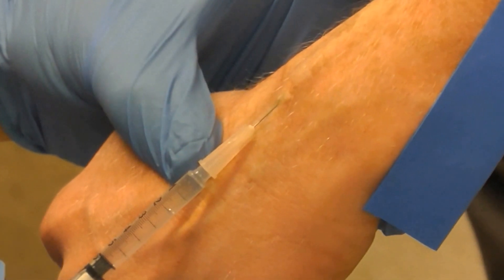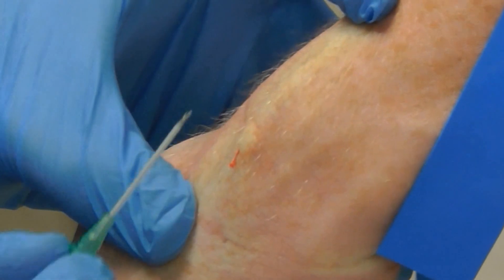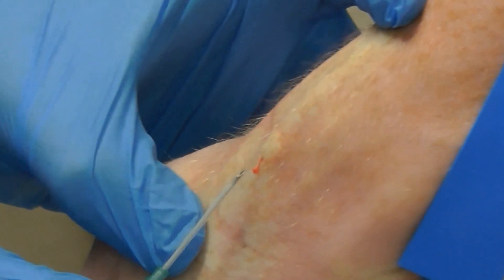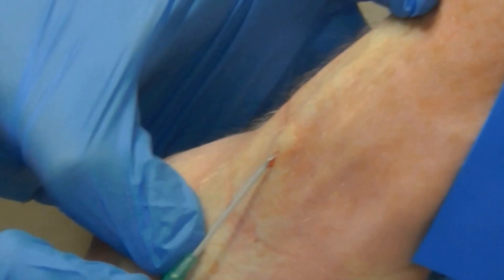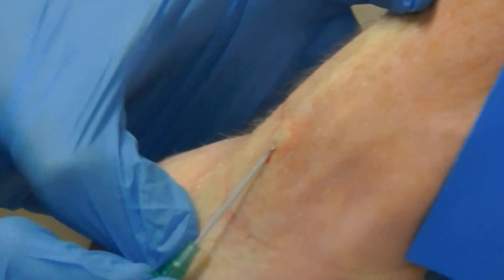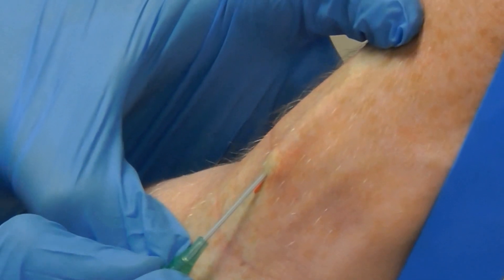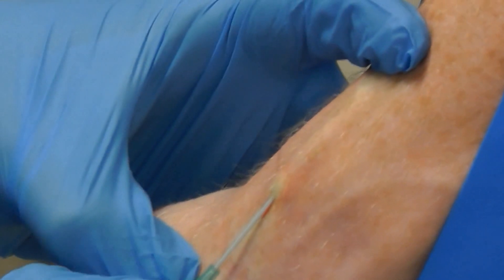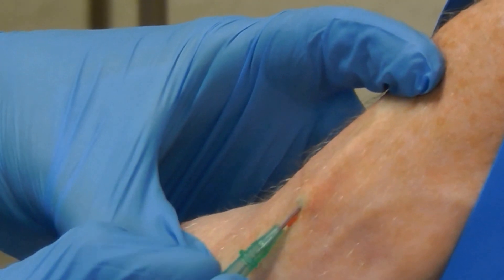Make this nice little skin wheal there. I'm just going to do an IV, so good traction in both directions. My needle is 100% parallel. I'm holding the angiocath correctly, so I'm just going to go in. I've now hit his vein and I've advanced the needle. So there's my angiocath.